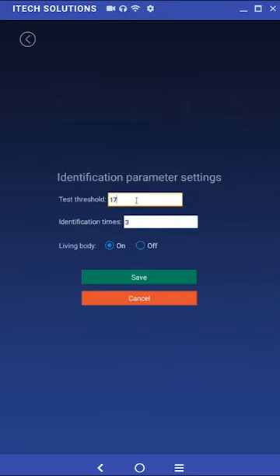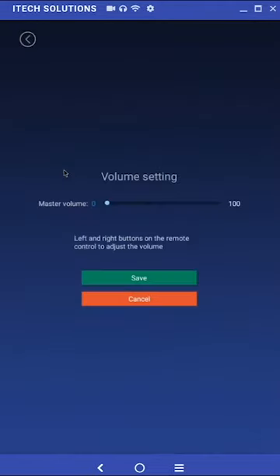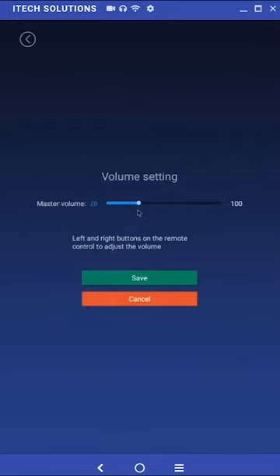The last setting, living body, can be set to on to enable biometric detection when identifying personnel. Clicking on volume setting in the application setting menu will bring up a volume slider. Moving the slider down will lower the volume of both the alarm and voice feedback. Moving the slider up will raise the volume of these settings.